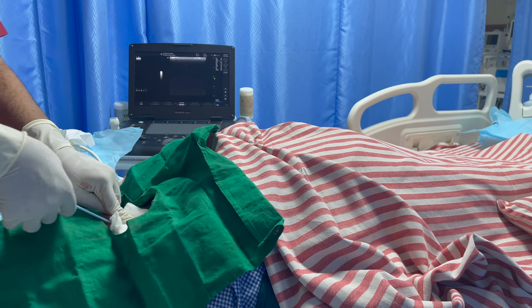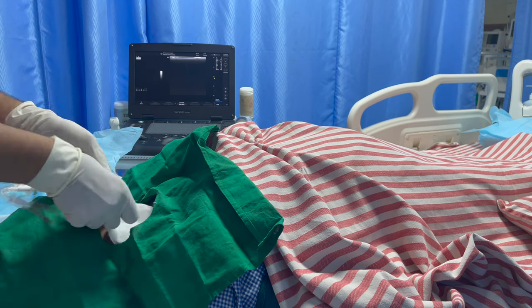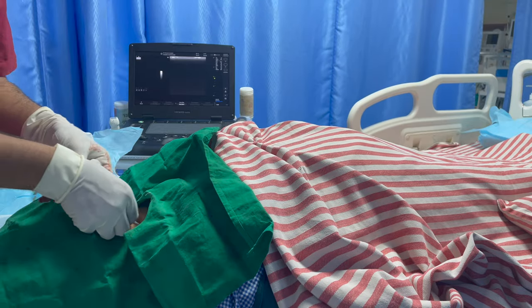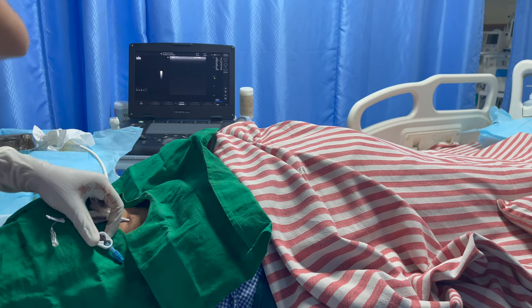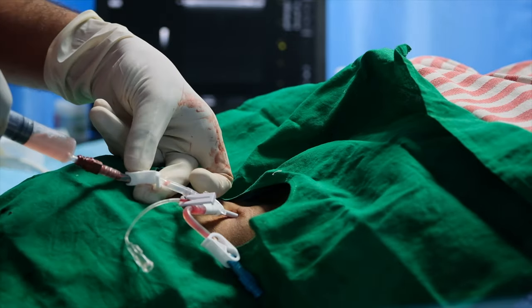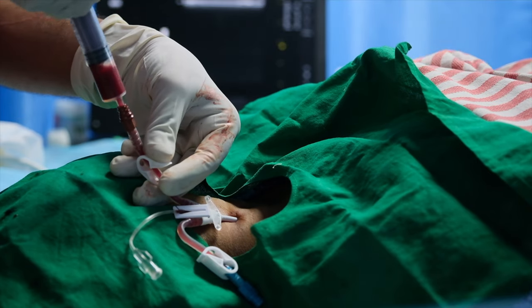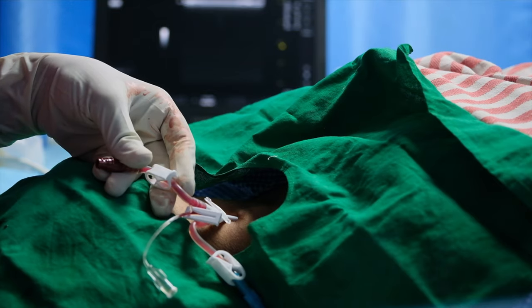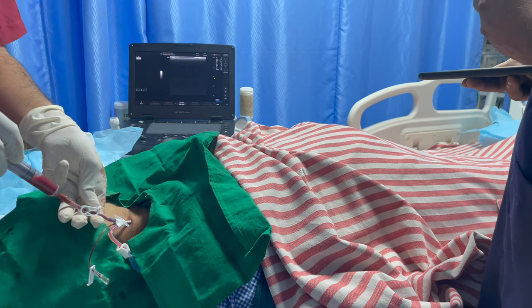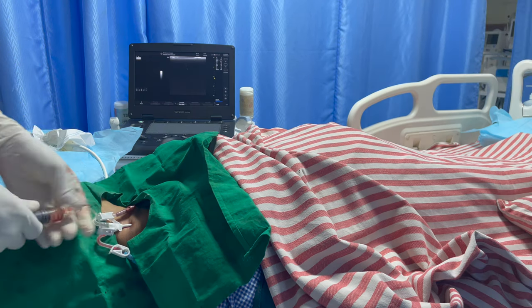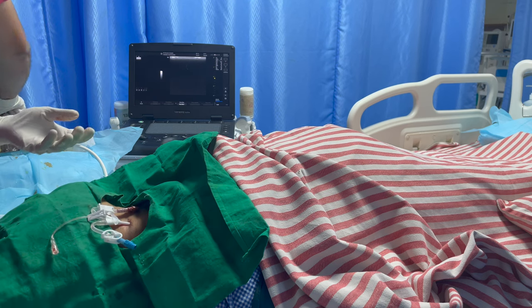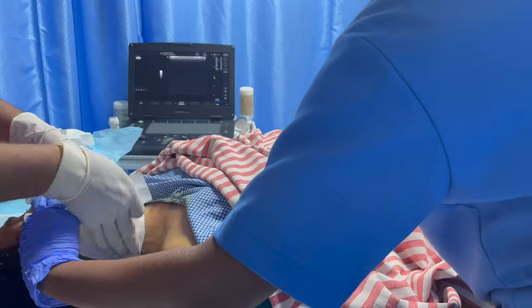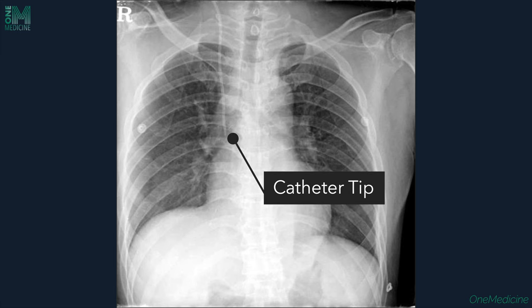Now slowly remove the dilator, taking care not to pull the guide wire out. Then slowly insert the dialysis catheter. Once the guide wire comes out of one of the ports, push the dialysis catheter gently until the required length is achieved, then slowly pull the guide wire out. Check for flow of blood from each port using a syringe loaded with 1–2 ml of normal saline. Push the blood back into the catheter with the syringe held at 90 degrees from the ground until 1–2 ml of blood remains in the syringe — this prevents air from entering the port and causing air embolism. Then flush each port with clear normal saline or minimal heparin. Once this is achieved, suture the catheter in place and apply dressing over the neck. Confirm placement with a chest X-ray; in correctly catheterized individuals, the catheter tip will typically be located at the level of the carina or 1–2 cm below it.